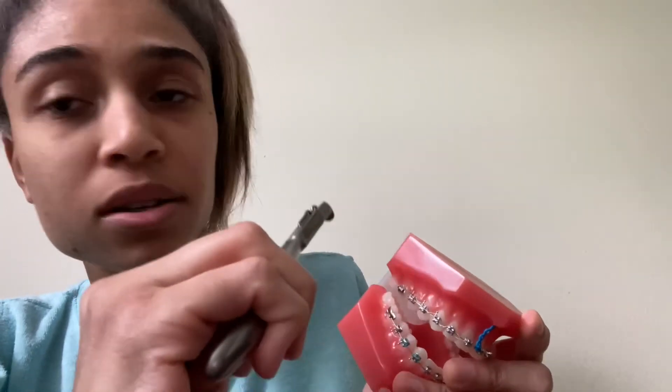This is a distal end cutter. I also hold it the same way. Pretend this is the patient's mouth — I'm going to go in like this. You're not going to go in like this because you're going to go down their throat. You go in towards the bracket, as much as you can towards the bracket, and just cut. If you cut a wire, make sure the wire is attached to this distal end cutter. If it's in the patient's mouth and you can't see it, get a dentist or an orthodontist — because the patient can literally choke on that.